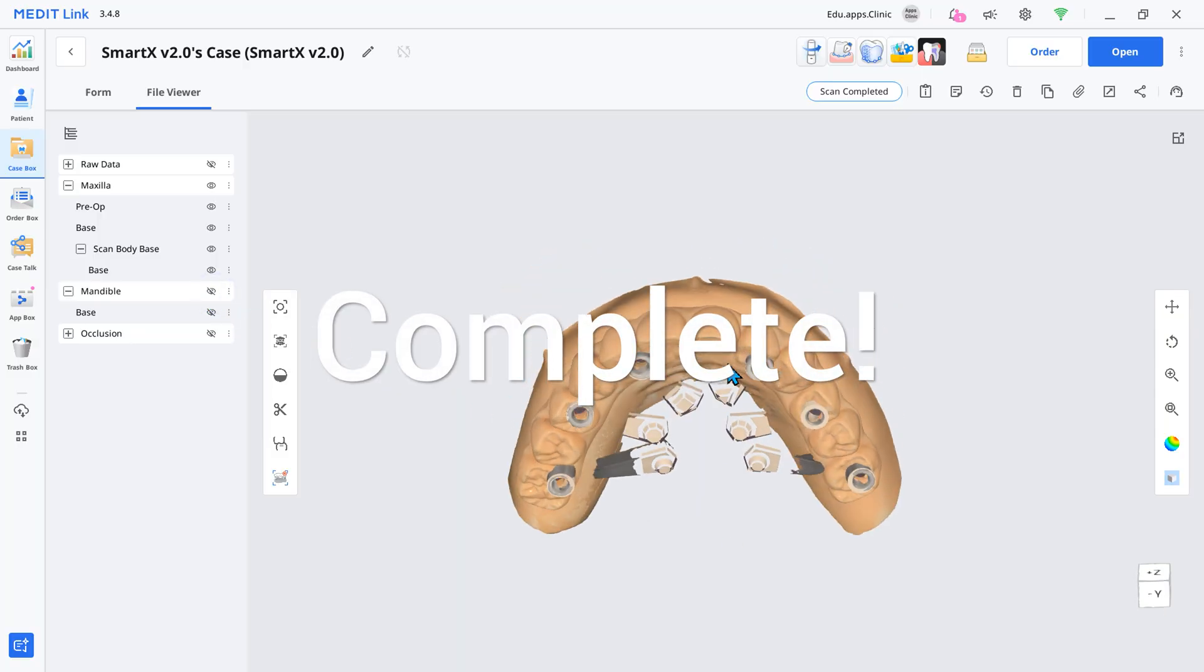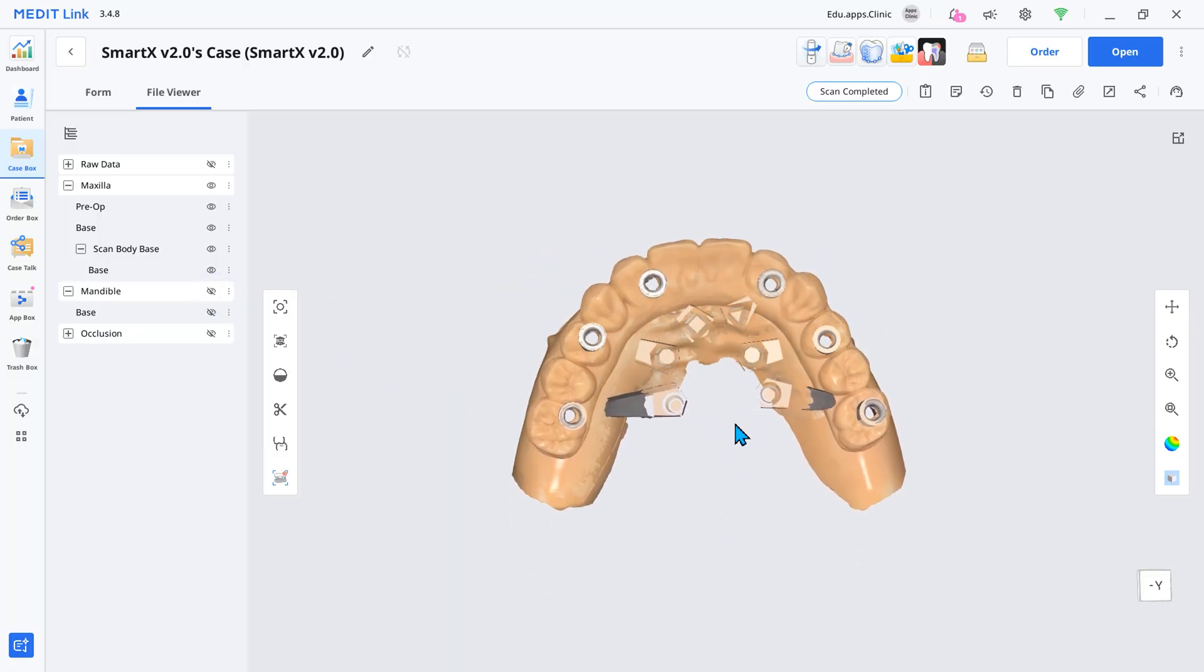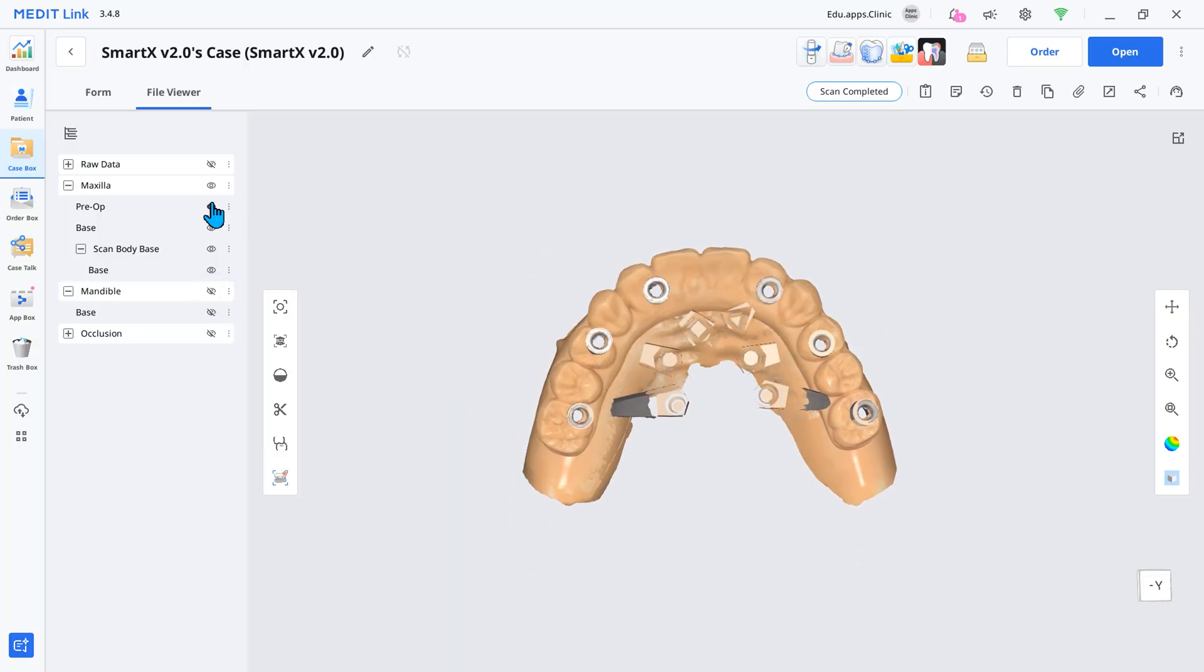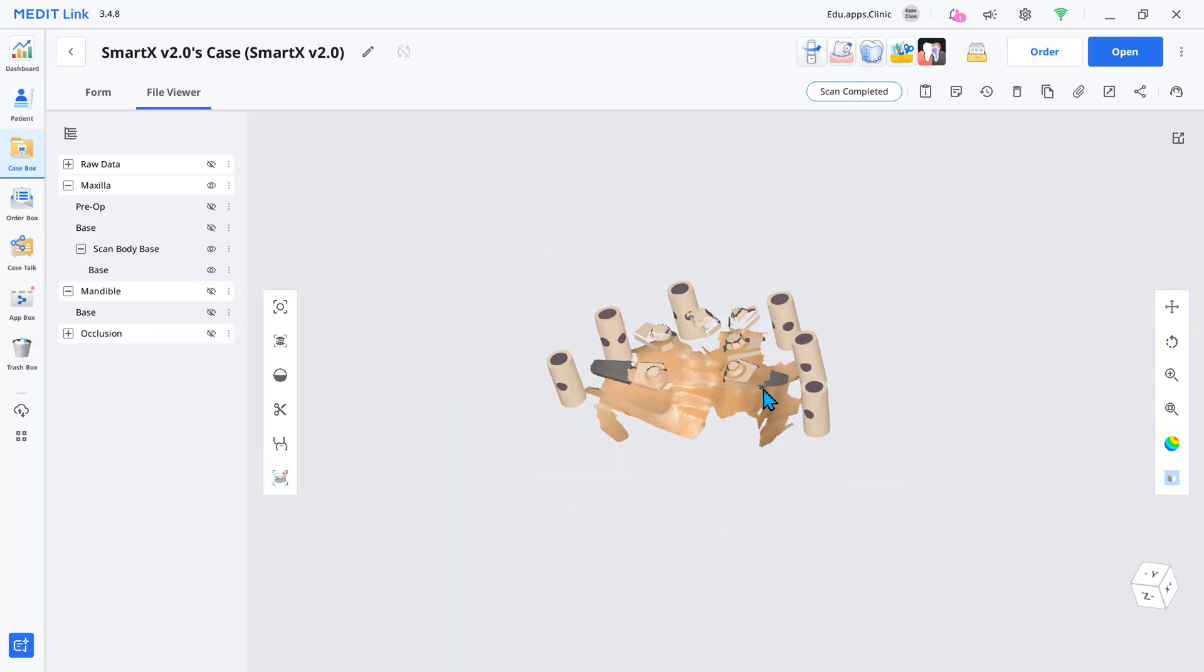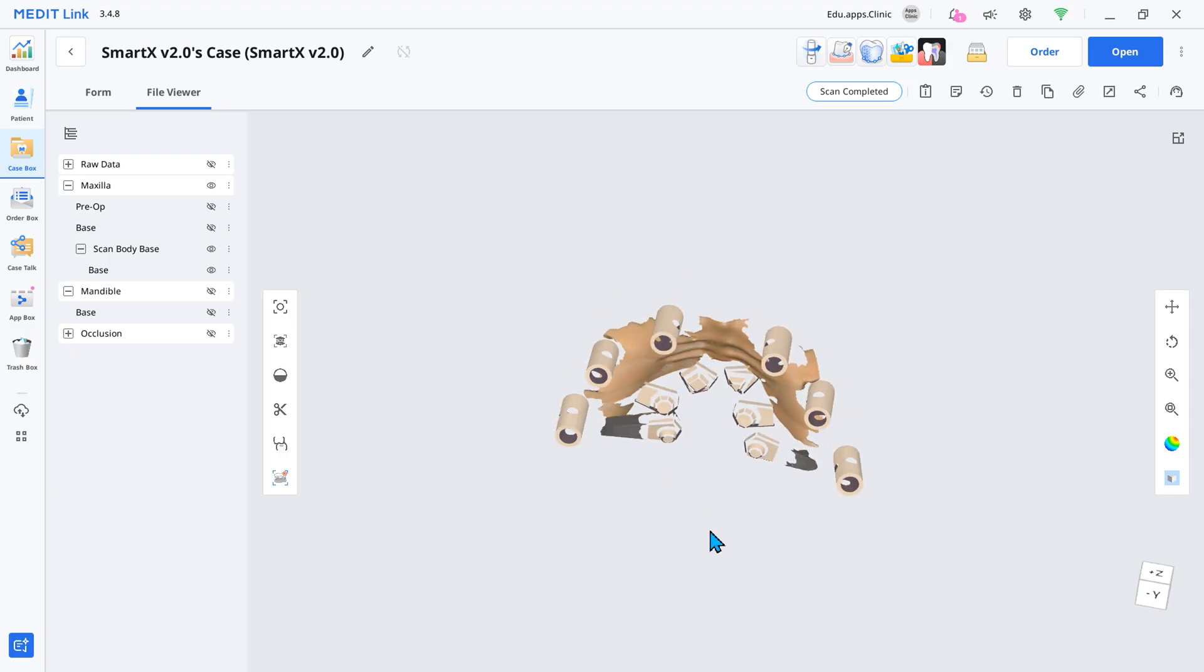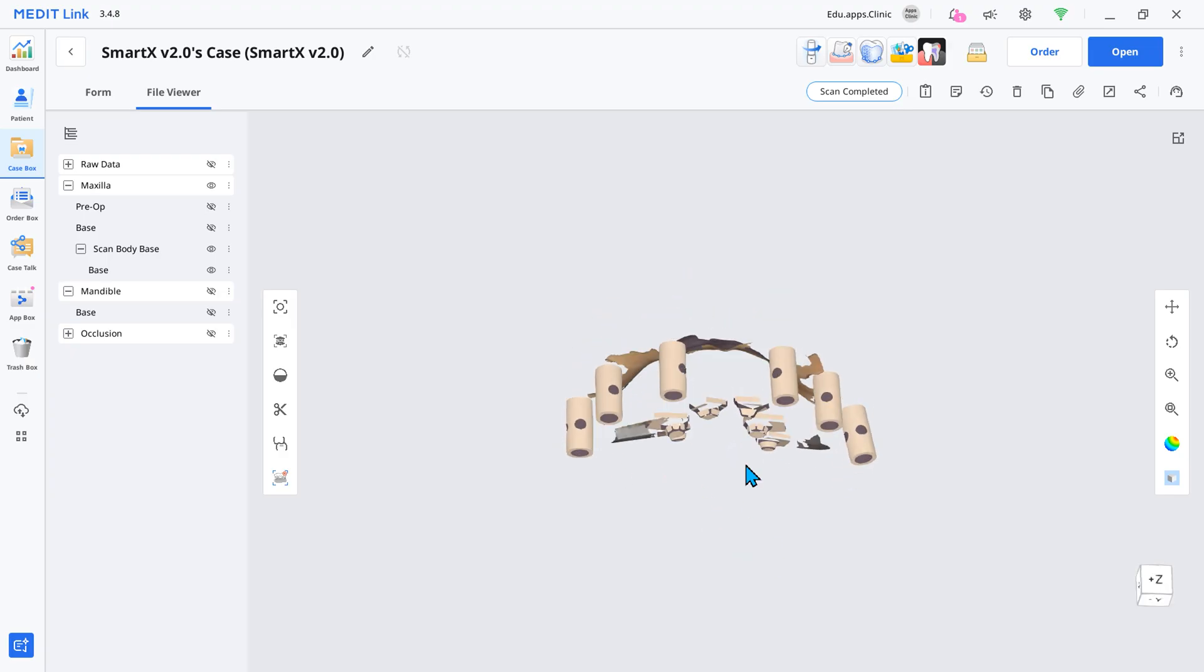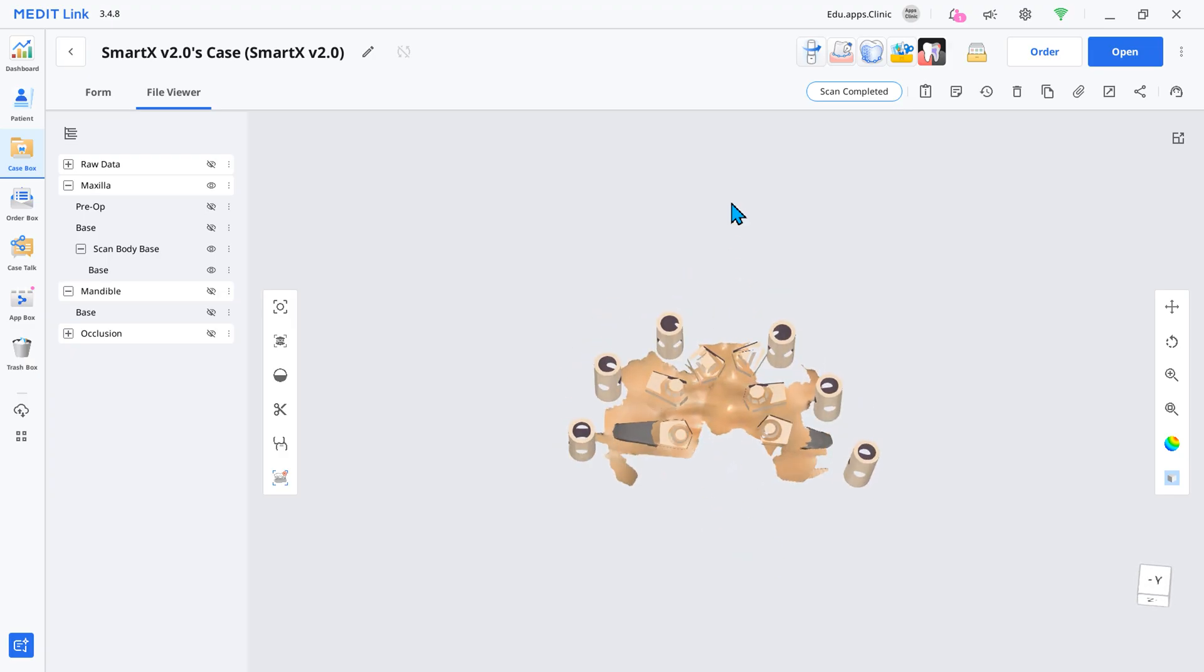With this simple scanning process, the all-on-X scan is complete. Experience improved clinical outcomes with Medit's new workflow.